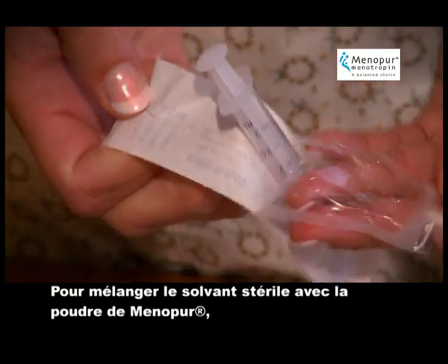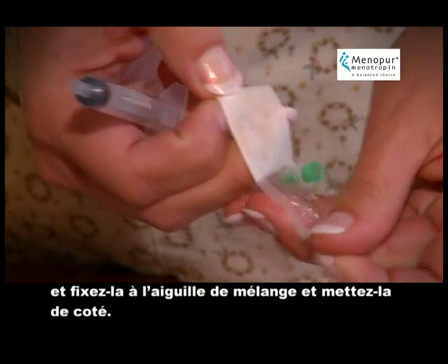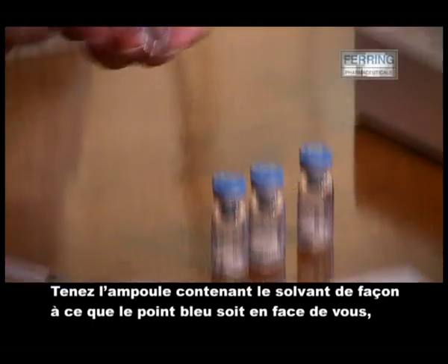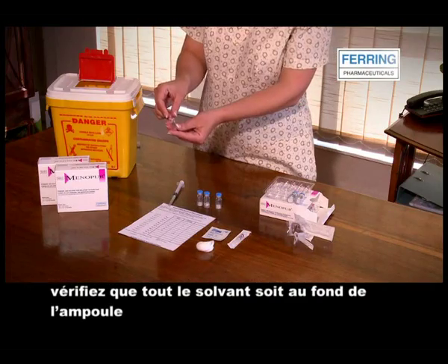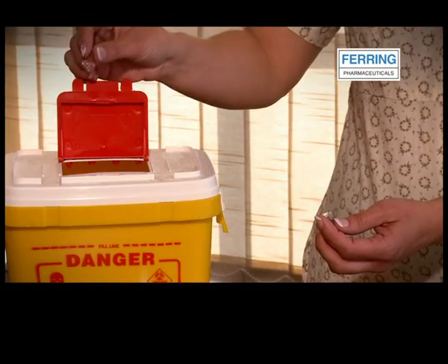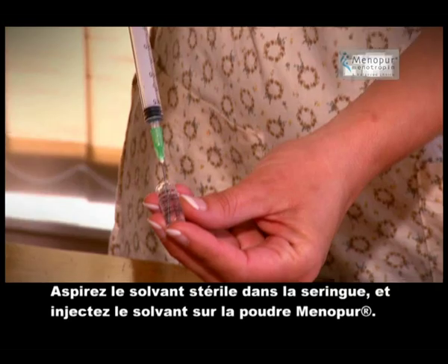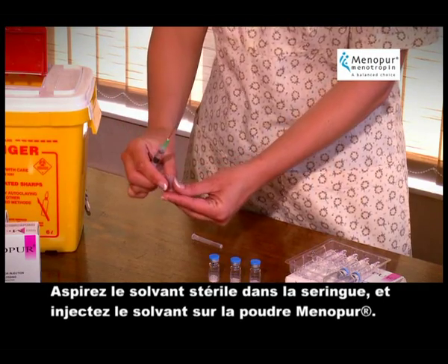To mix the sterile solvent with the Menopur powder, first remove the syringe from the wrapper and put on the mixing needle and set it aside. Hold the ampule with the solvent so that the blue dot is facing you. Ensure that all the solvent is at the bottom end of the ampule and then snap it off by pushing the top end of the ampule away from your body. Draw the sterile solvent into your syringe and inject the solvent into the Menopur powder.